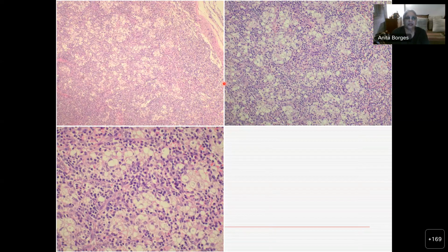Anybody? So there is Dr. Bhakti, who has said leprosy. Somebody said crypto. Somebody said Rosai-Dorfman disease. Okay, I can see some of them. Fungal, cryptococcus. Yeah, I suppose any or all of these should be considered, because what you've got is a diffuse but scattered proliferation of these histiocytes. You can see the histiocytes, yes.